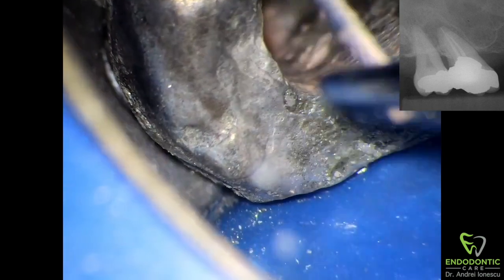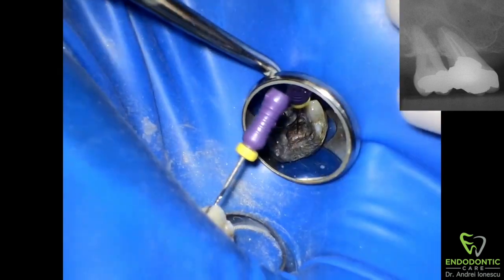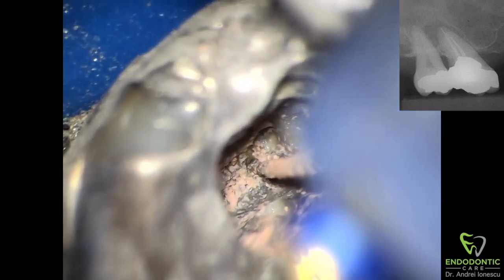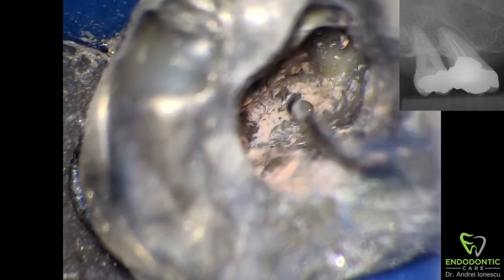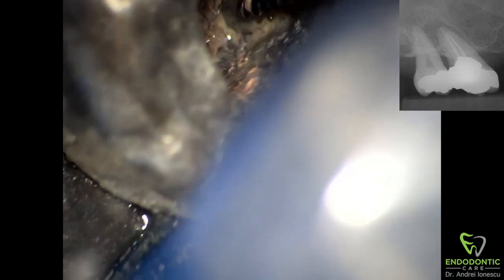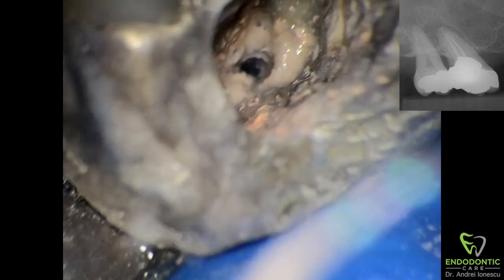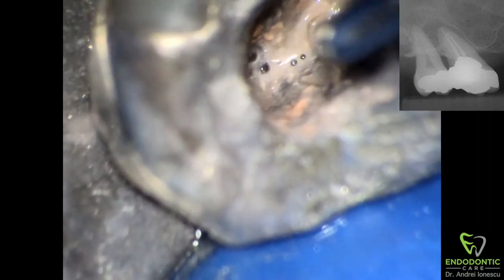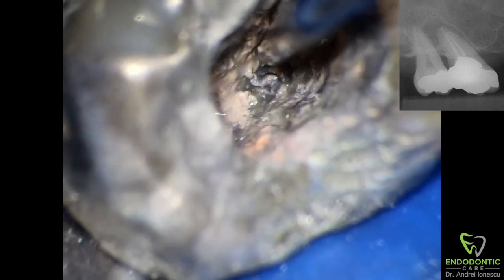The other canal was a lot more challenging, so let's not celebrate yet. We're going to go to the mesial buccal and start off exactly the same way — lots of liquid, lots of retreat solution in the canal, starting with a small 8 or 10 file, then switching to rotaries to create a path alongside the carrier. Always make sure there's lots of chloroform in there, otherwise things will get stuck. I'm going to try to create some space on both sides of the carrier, just flicking it with the explorer, trying to move it so I can get the rotary file on the other side of the thermofill carrier.